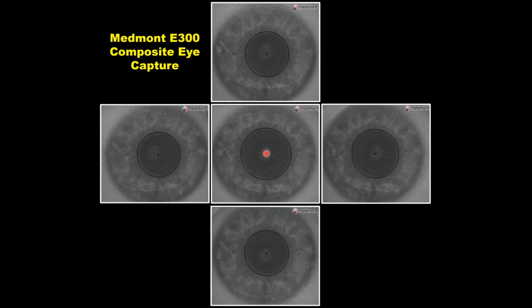What you basically do is have the patient fixate down the axis of the instrument. You take a central image. Have the patient fixate 1, 2, 3, 4 rings, usually 4 rings is optimal, toward the nose, and that will push the placido to the temporal side. Have the patient fixate 4 rings toward the temporal side, and that'll push the placido far to the nasal side.